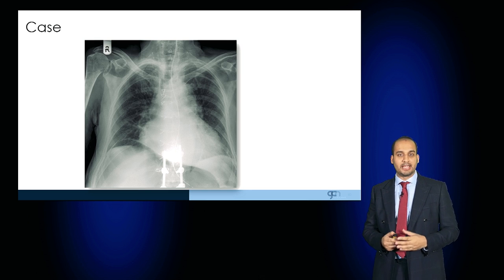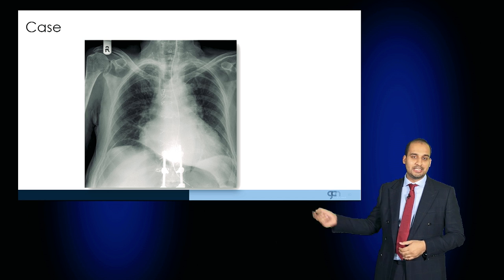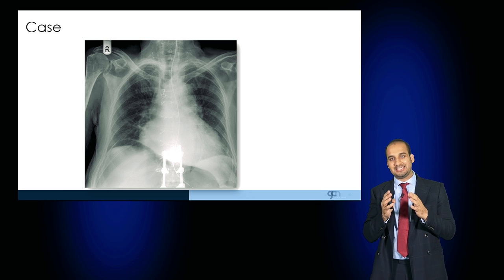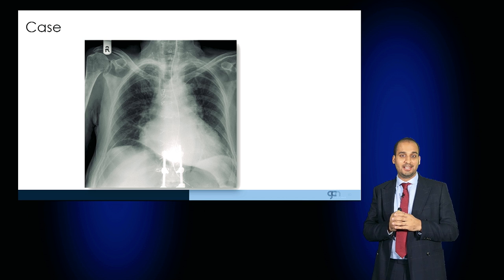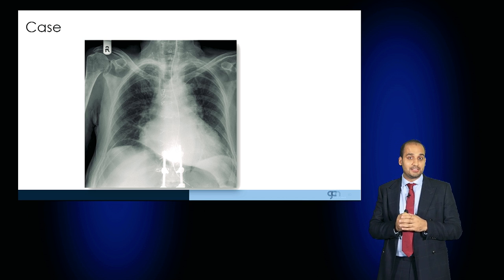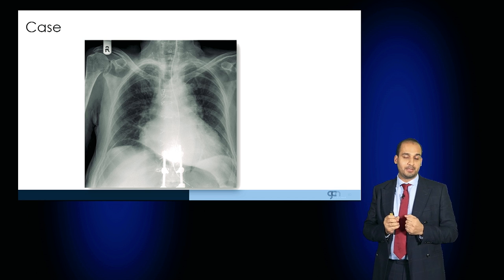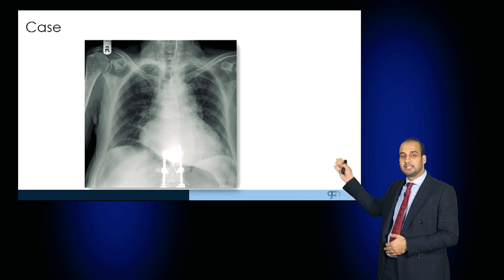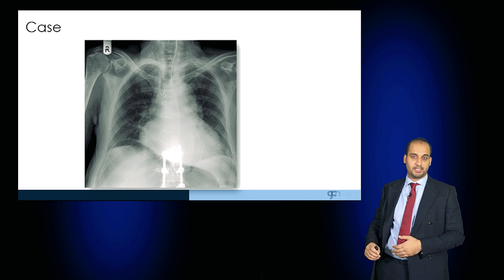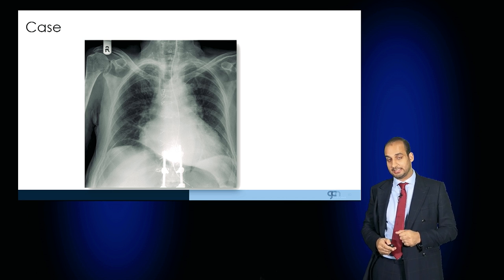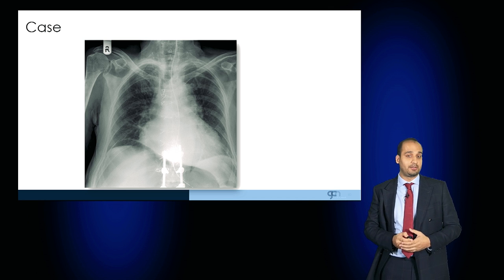Have a look at this chest radiograph — there are a number of foreign bodies, but I want you to see these ring-like metallic structures. These are post-cardiothoracic surgical sternotomy wires which are keeping the sternum together. You can also see that the patient has had some spinal surgery with spinal rods visible. And this patient also has an NG tube in situ — quite a good radiograph demonstrating an array of foreign bodies.